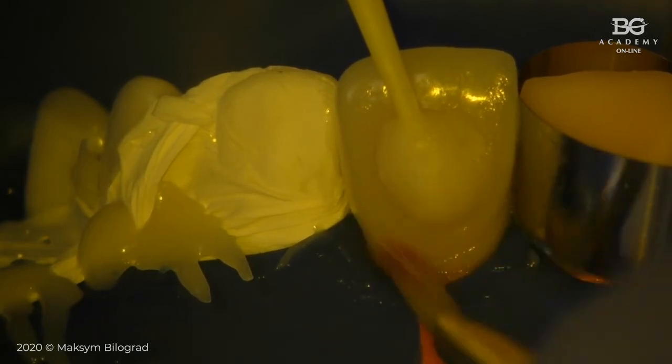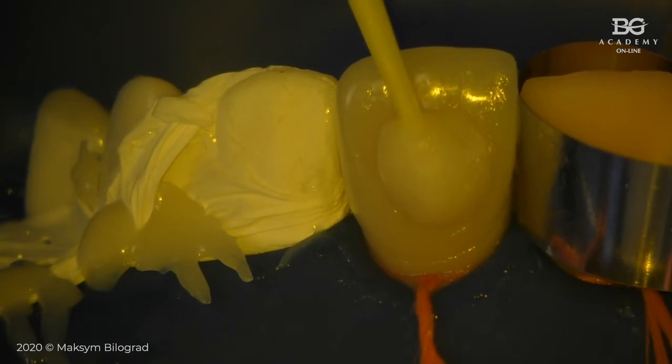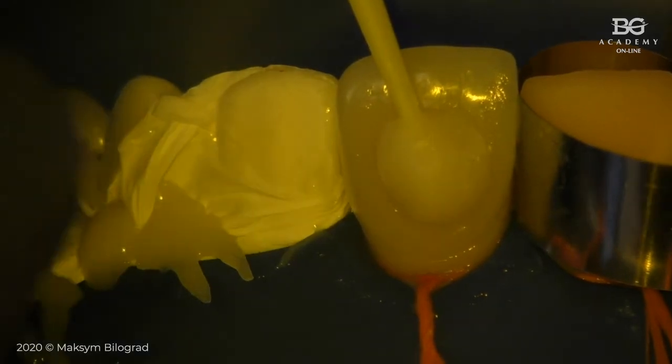Then I can double check if the fit is correct, if the position of the veneer is correct. If my fit or position is not correct, I can move it. So I can be really sure that the position is correct.